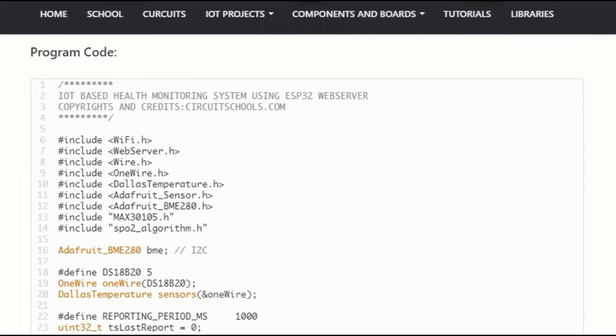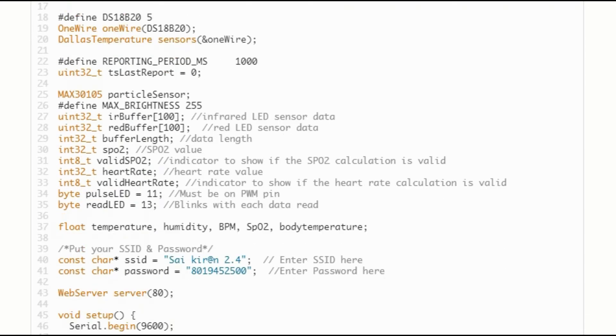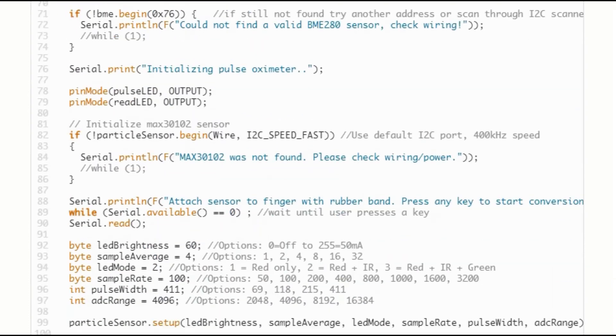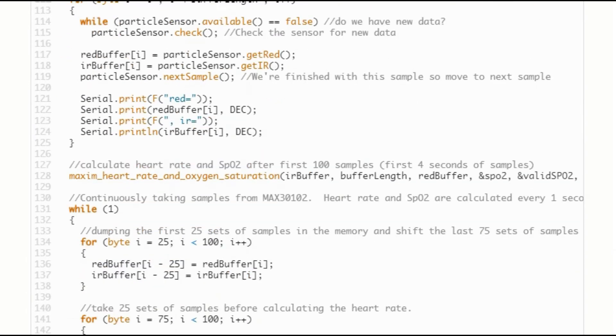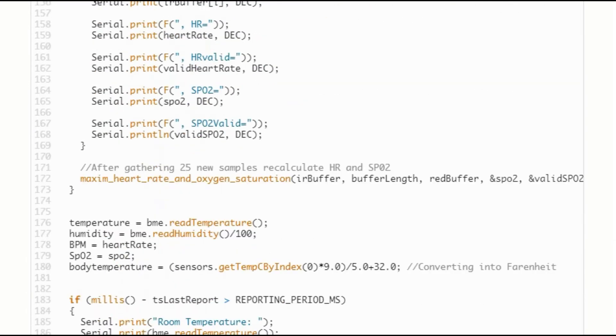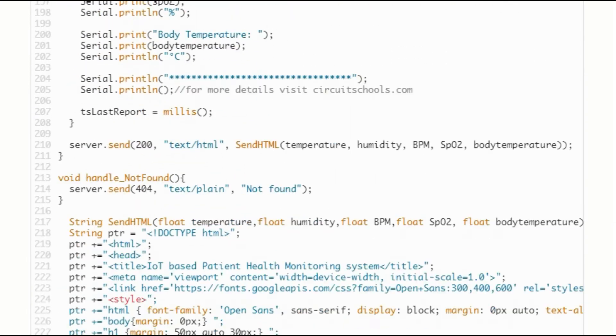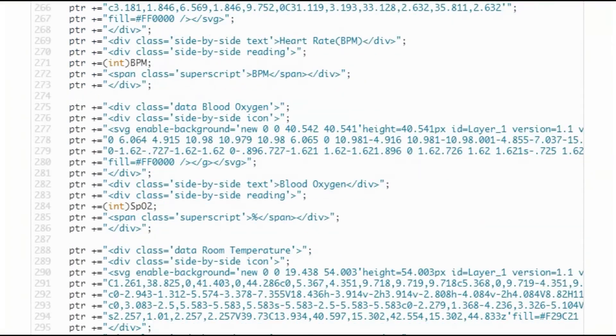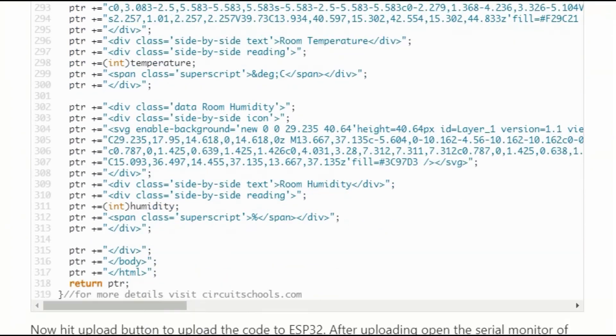Now refer to our website circuitschools.com for the program code, paste it in the Arduino IDE, and upload the code to the ESP32.